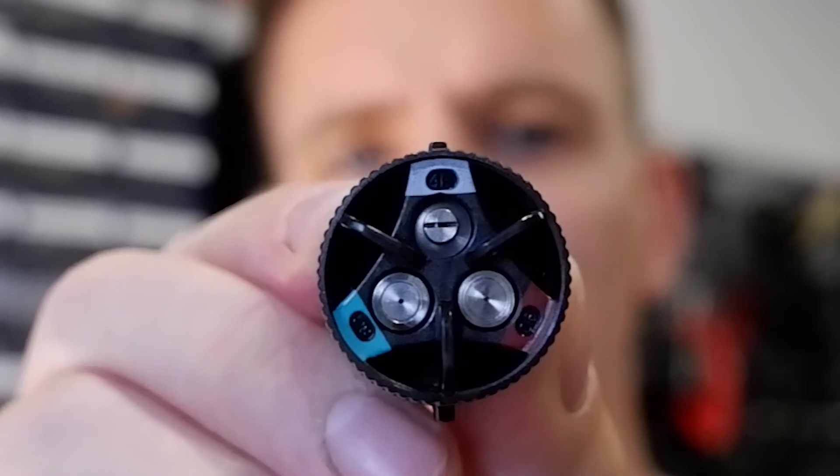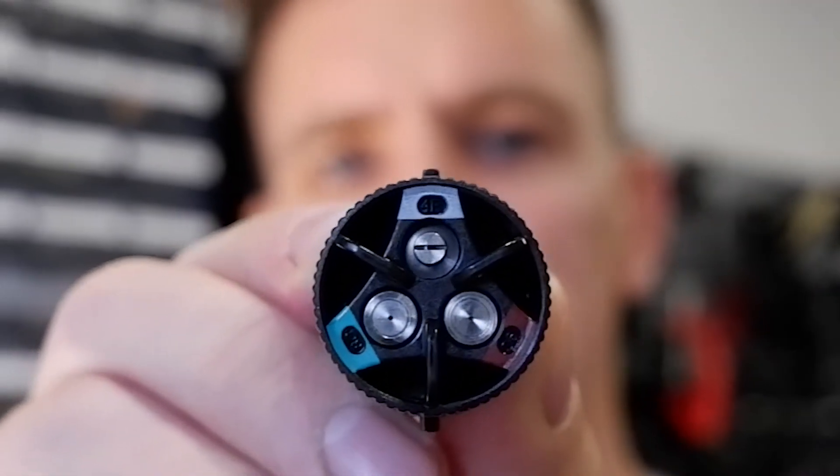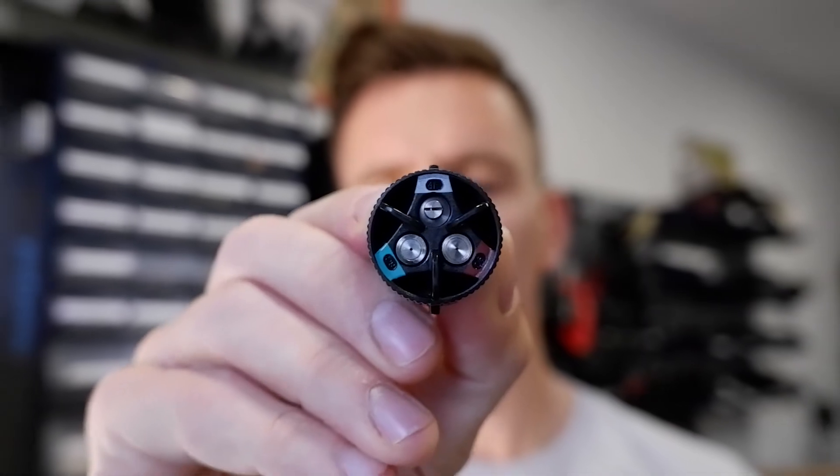Finally, all the way around is your white setting, and when that is at 12 o'clock it gives you 110 microns, which is your biggest particle droplet size. This time it's a fan trajectory, so the spraying shape will be in a fan — hence the slightly different shape of the aperture on the nozzle.